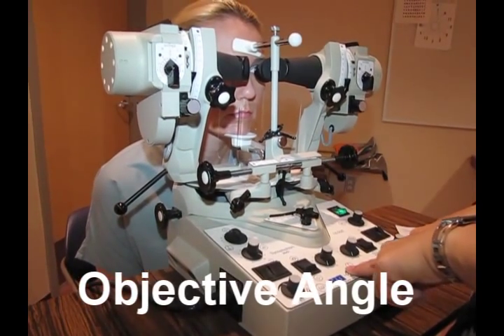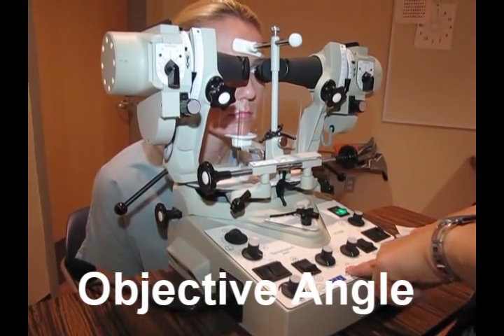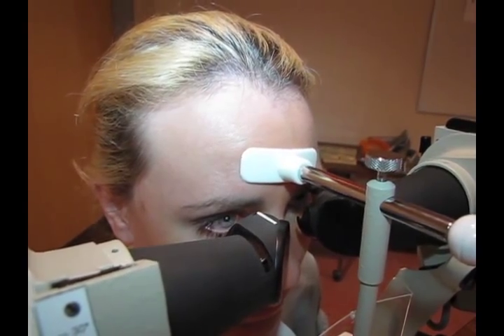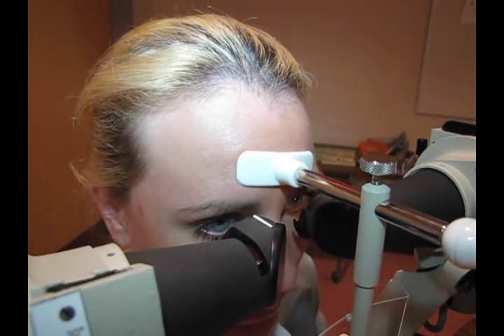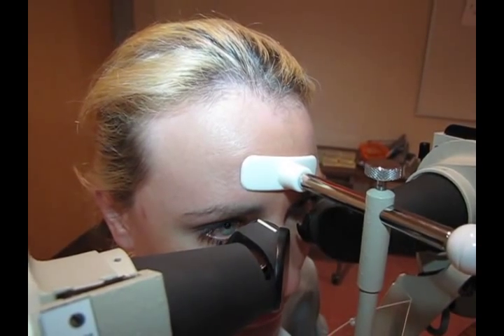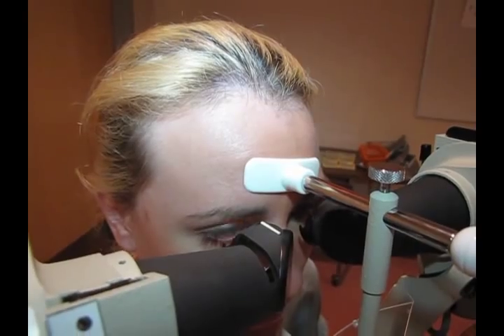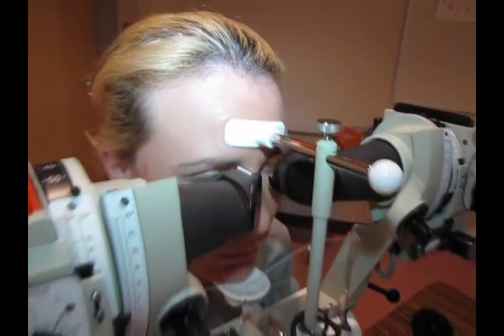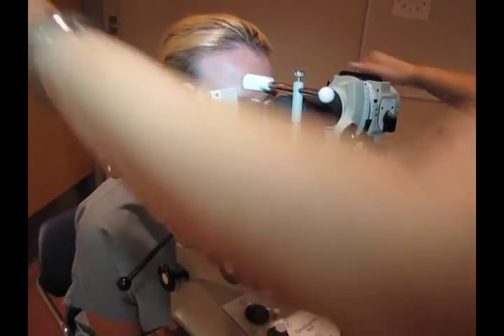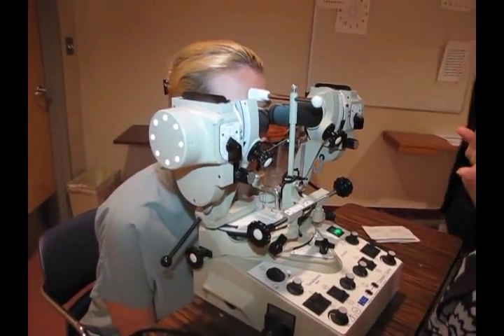So now what are we seeing? We're seeing an in movement. So remember, you're watching the eye that is lit. Here we go. The right eye just moved in. Now I'm looking at the left eye, just moved in. Meaning if the eye moved in, it means that it's exo, right? So we're going to move the machine. If it's base in, it's base in towards the patient. If we needed to neutralize base out, it would be towards the doctor.